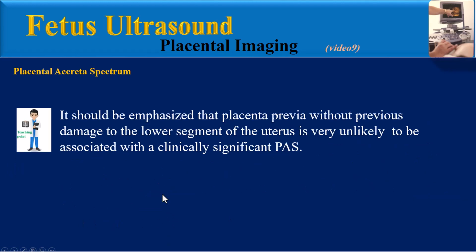It should be emphasized that placenta previa without previous damage to the lower segment of the uterus is very unlikely to be associated with a clinically significant Placenta Accreta Spectrum.